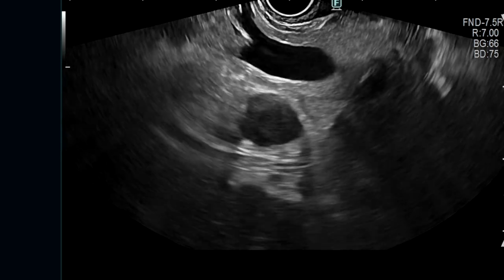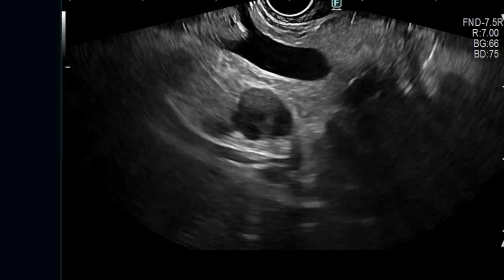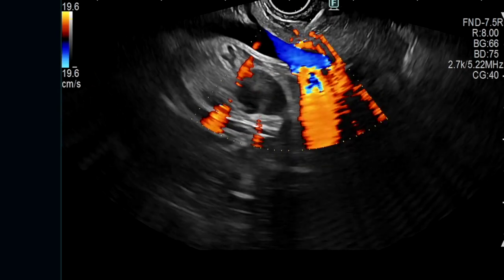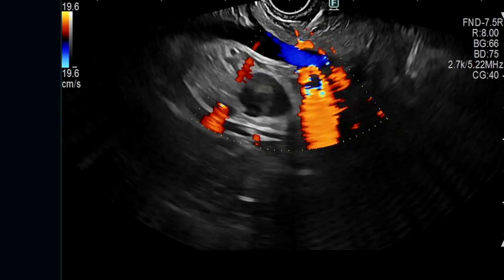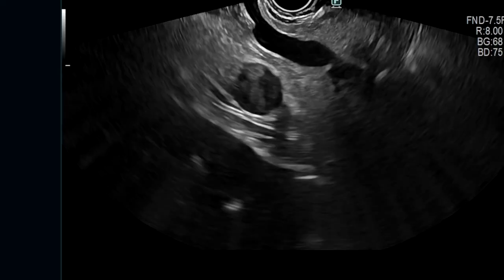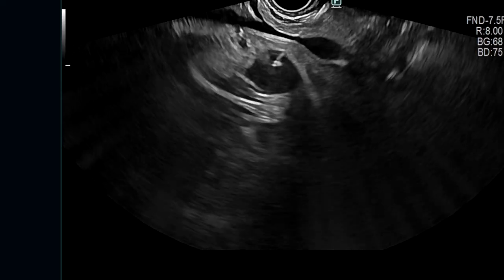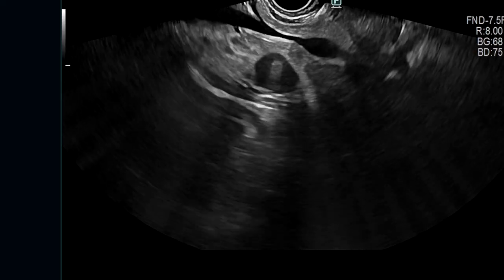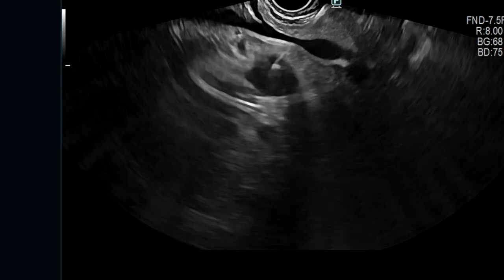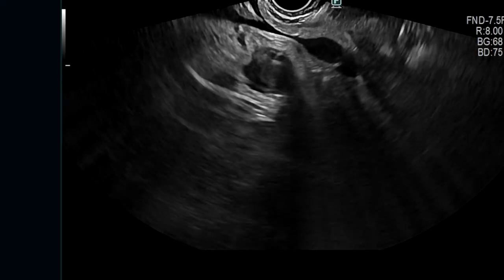This 57-year-old female with abdominal pain presented with a 15mm sized mass in the pancreatic neck region noted on CT scan. At EUS, a 15mm solid mass was seen posterior to the portal vein with no clear window for tissue acquisition. A 25 gauge Expect FNA needle was positioned at the interface between the stomach wall and the portal vein, ensuring minimal distance between the target and the needle, with a technician bracing the scope out the mouth of the patient to prevent recoil, and after applying suction so that the scope is closely approximated with the gastric wall, a rapid thrust is made to advance the needle via the intervening portal vein and into the mass.